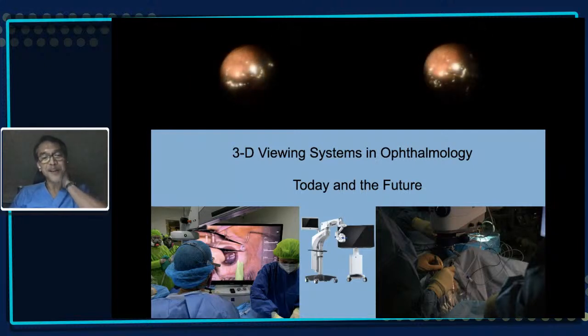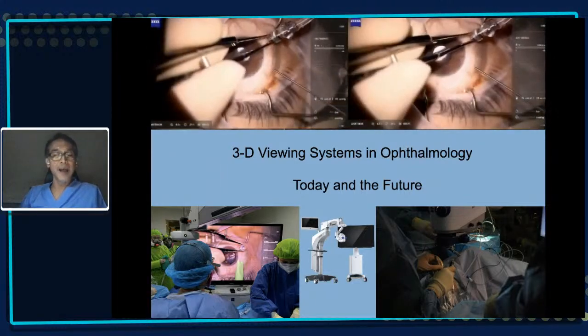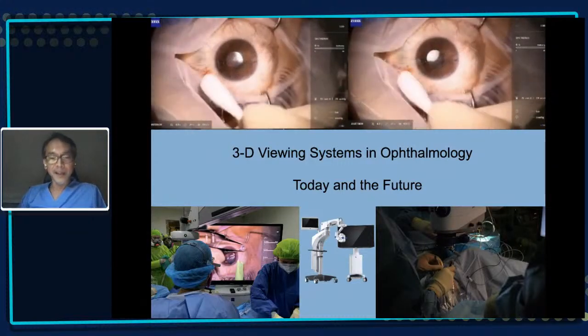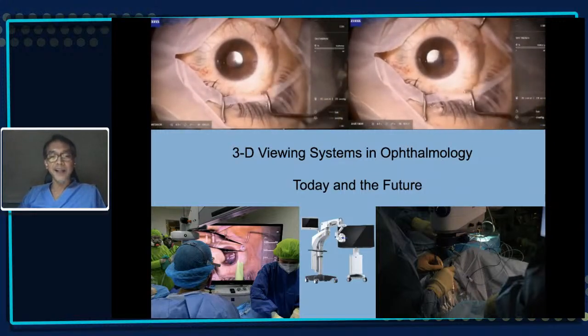Now, three-dimensional display systems are showing ever-promising results in the field of ophthalmology, both for anterior and posterior segment surgeons. Head-up surgery using a 3D viewing system has been increasingly accepted. The technology will surely continue to develop. With great image quality, outstanding depth perception, and spatial orientation, we will be having a more natural visual experience, both as the surgeon and especially as the trainee during this time of pandemic. This technology will prove to be an excellent tool for live surgery and training in the short term. Thank you.